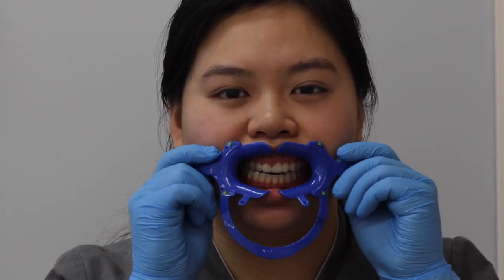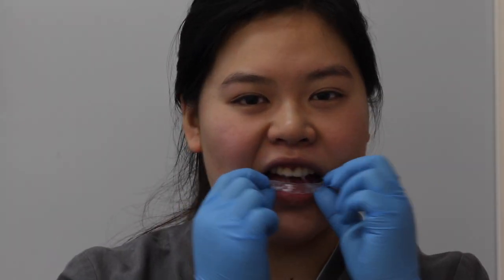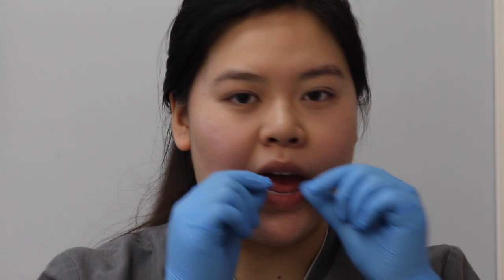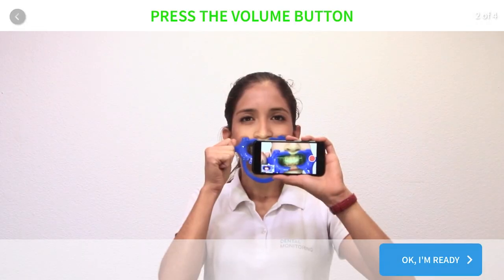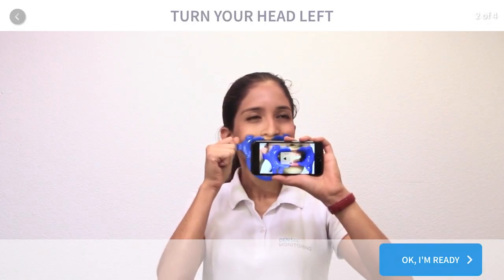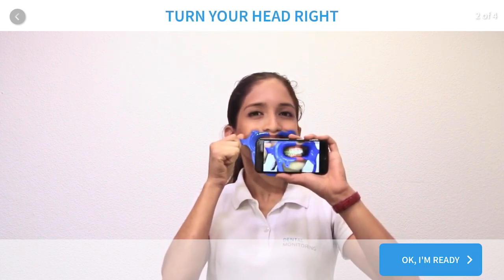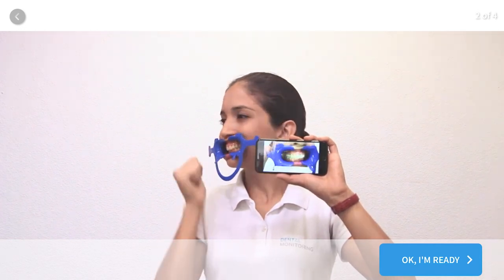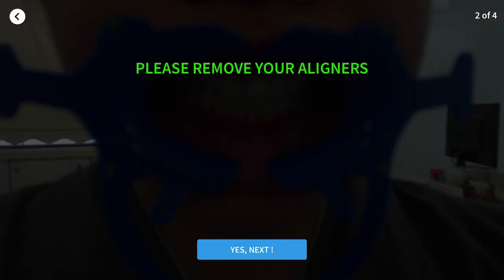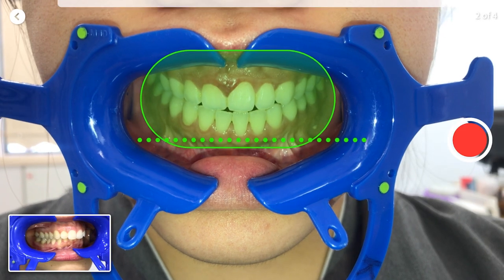For your next scan, remove your lip retractor and your aligners. Once you've removed your aligners, watch the tutorial to take your next scan. Click OK and ready to start your next scan. Make sure your aligners are out at this stage, then click yes, next.